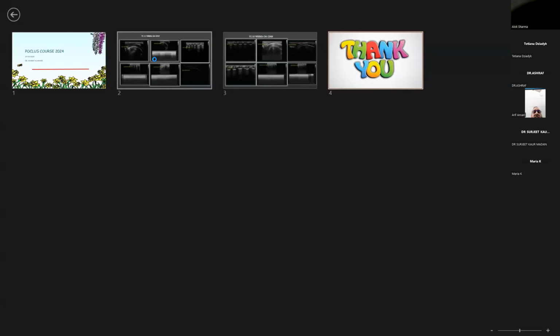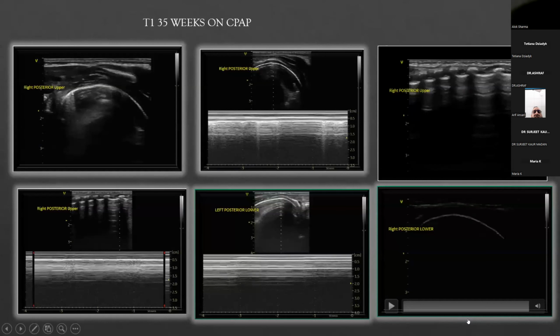It's something very common. It's something that I see. It's something that all of you will see and leaves a lot of confusion. I'll explain why.